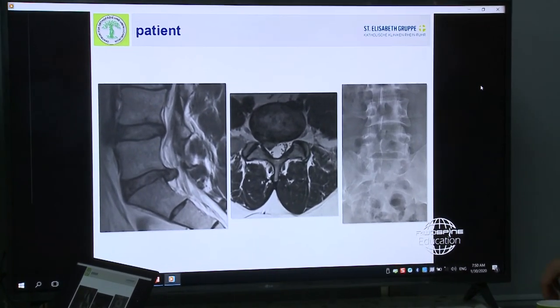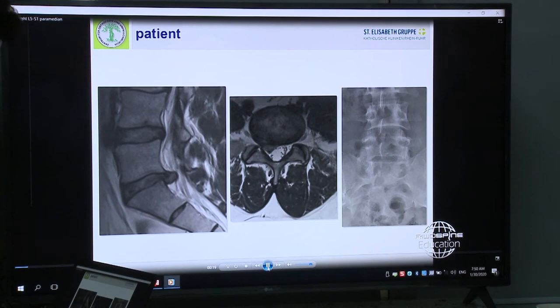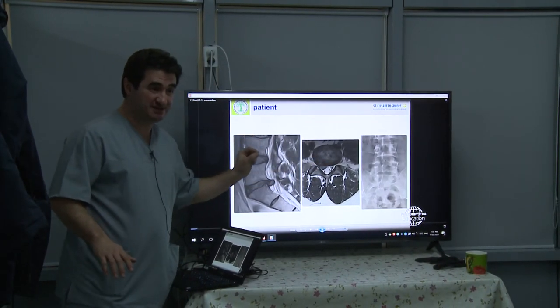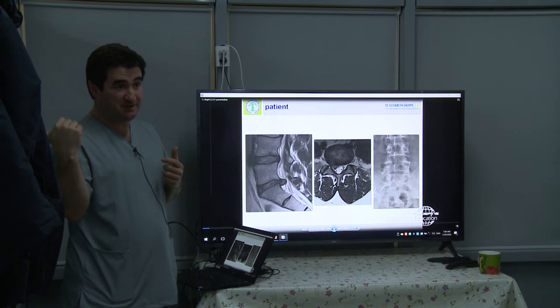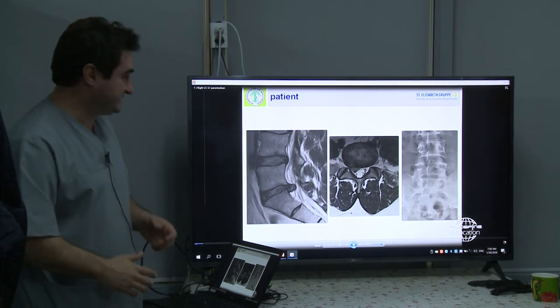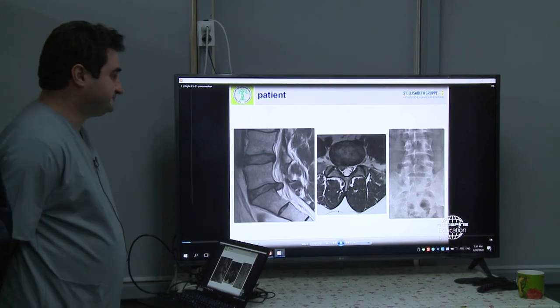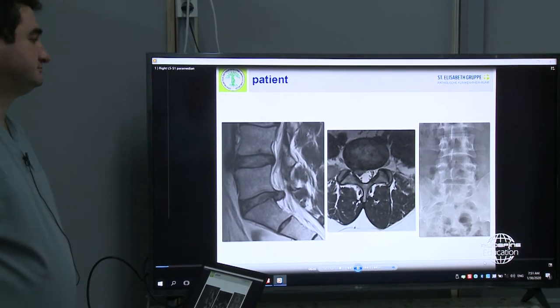Just to give you an impression, we have a herniation located on the right side here. We always recommend you to start with these kinds of cases: a big interlaminar window, as you see, and a very small herniation. Then it will be much easier at the beginning to remove it. If you start like the morning case, you need to work a lot and maybe leave some rest. But always start with a big interlaminar window and small herniations, in the sagittal and transversal planes, where the interlaminar window is feasible.